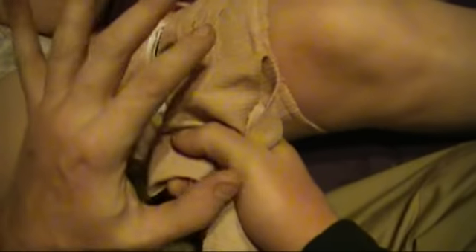And you would wrap this around the leg, and you would crank it tight, right across the spot where it's bleeding. Pass it around. Crank the thing down. I mean, put some real effort into it. Don't be like, ooh, I'm just going to wrap it softly.